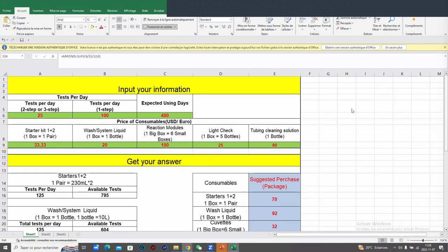You will get much information on how to get the results information from the website and so on. And it is true not only for Snibe, but for all the other brands, because Roche and Siemens and so on also use third-party quality control.